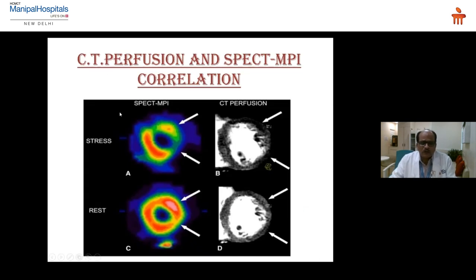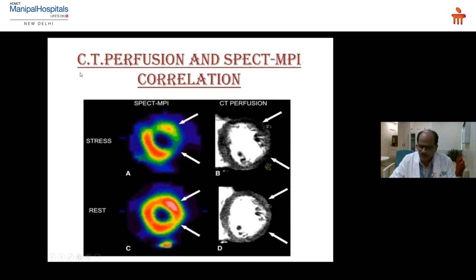This is an image comparing SPECT MPI and CT perfusion. In the rest image there is normal perfusion, but on stress there is a perfusion defect visible — the perfusion defect is seen similarly on both CT perfusion and SPECT MPI.